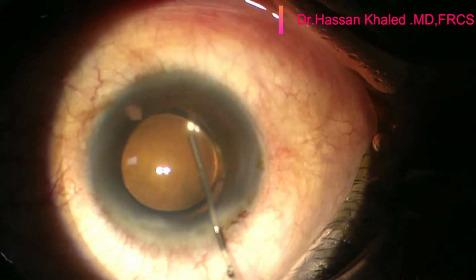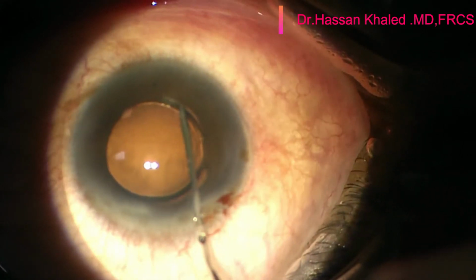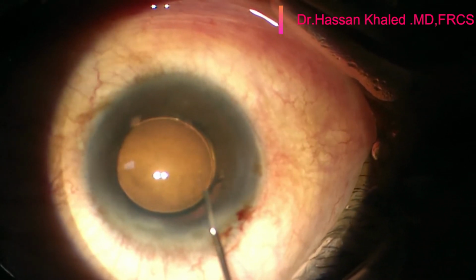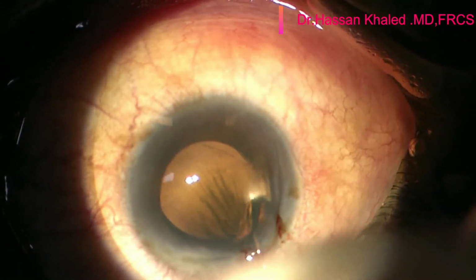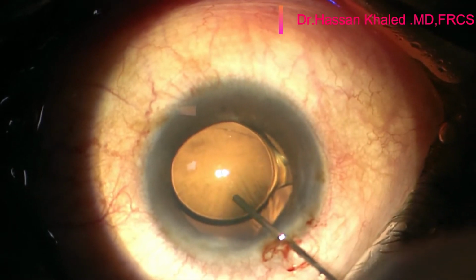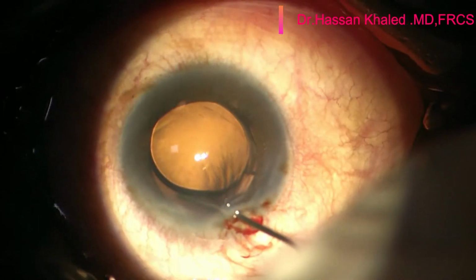Then the OVD was used to reopen the capsular bag around the optic and around the haptic, and also was injecting behind the IOL to reform the capsular bag and to free the optic from the posterior capsule, along with freeing the haptic also for both sides from the capsular bag fornix.